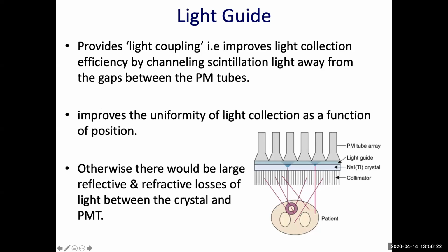So this improves the uniformity of light collection as a function of position. Otherwise, there would be a large reflective and refractive loss of light between the crystal and PMT. So it's just to enhance the collection of light photons by the PMT. Okay, it doesn't have other roles.